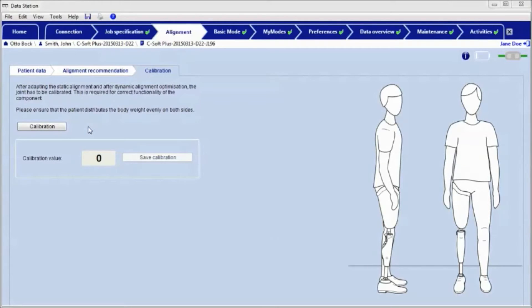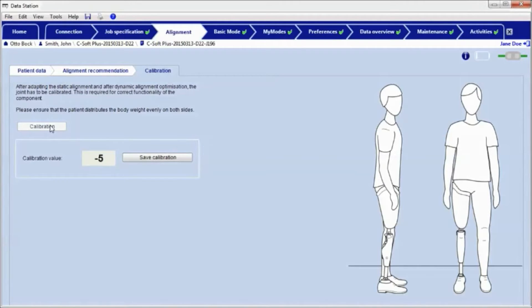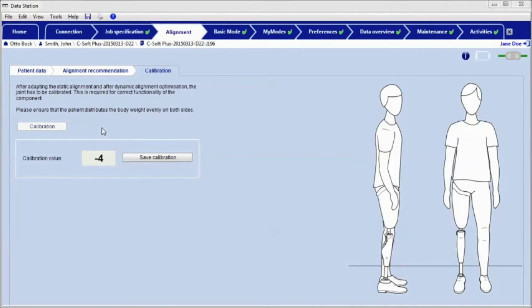Start the calibration by clicking the calibration button in the adjustment software. The current inclination angle is displayed. Please take care that the patient is standing secure with a stable posture and that the displayed value stays constant. Accept the value shown by clicking the save calibration button.